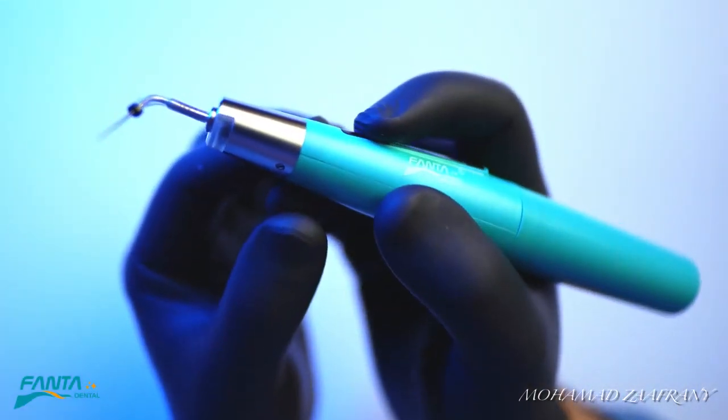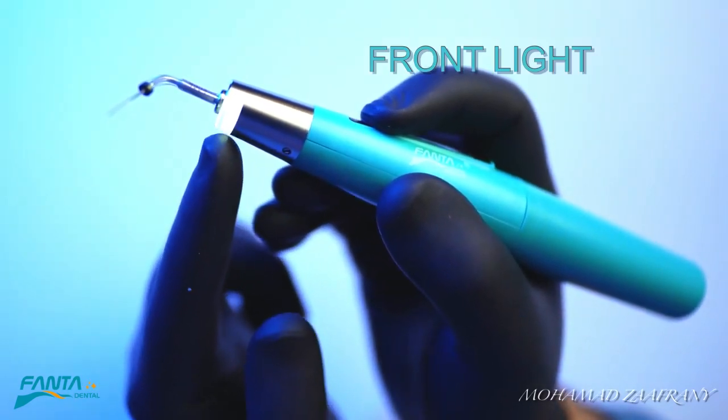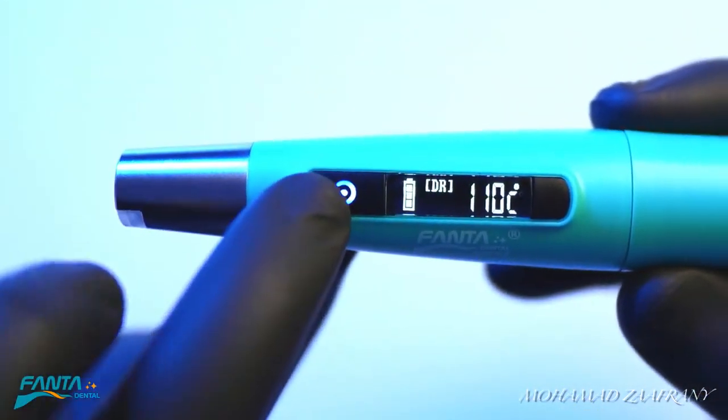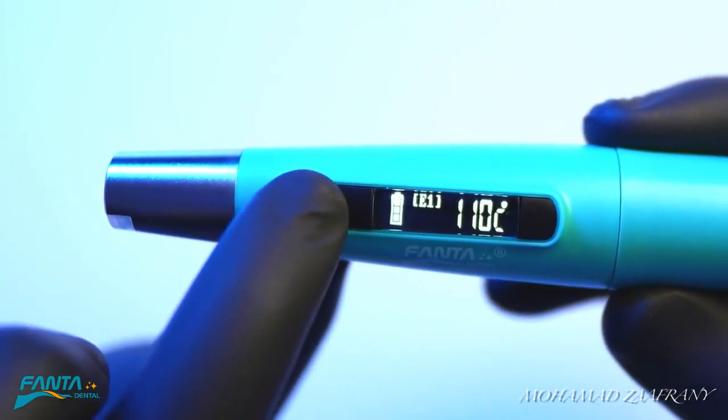It has a front light to aid in illumination of the operating field, especially if you are not working with a microscope or loupes. If you try to operate the device without the tip, it won't start operating.